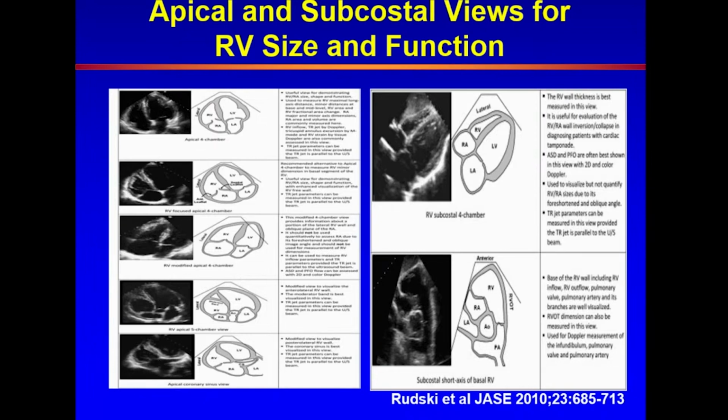Here it's the anterolateral wall, and here it's the posterolateral or infralateral wall. Subcostal views are very important because in some patients these are the only windows you have or the best windows you have. And so we will be able to see the RV, the RA, again, more of appreciation of what they look like size-wise, but not really suitable for any measurements except for the thickness of the RV, as we will talk shortly.